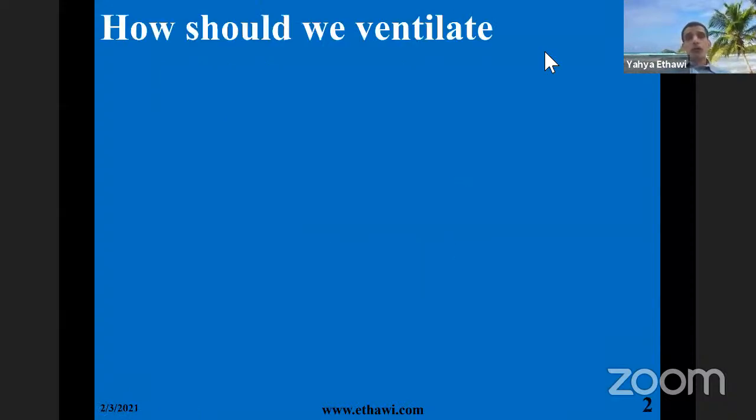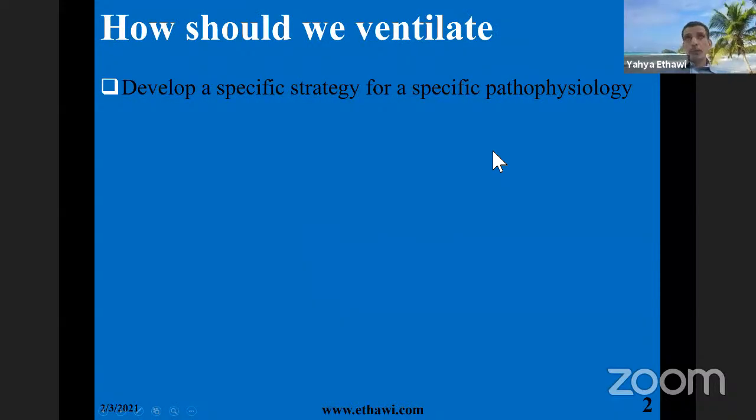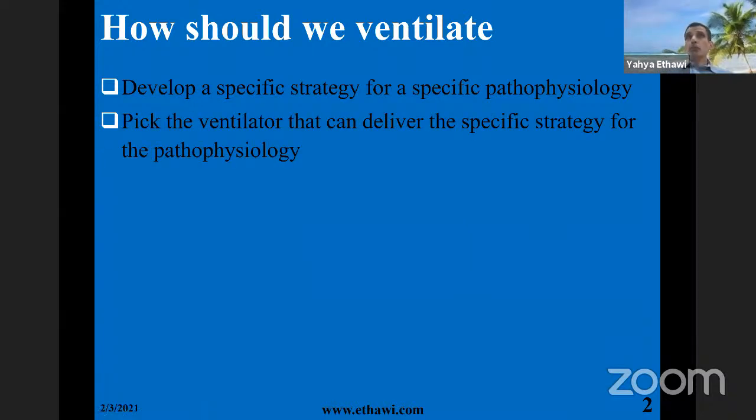So how should we ventilate a baby? Well, we need a specific strategy for each pathophysiology. And we have to pick a ventilator that actually meets that pathophysiology.